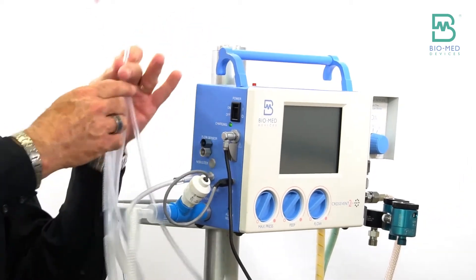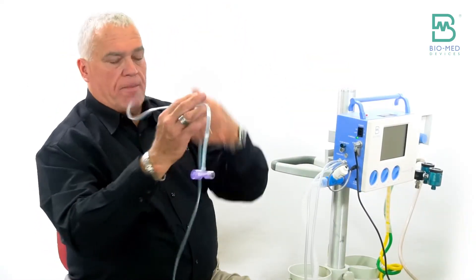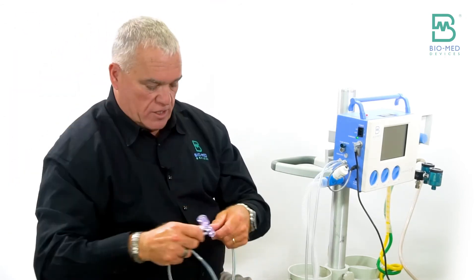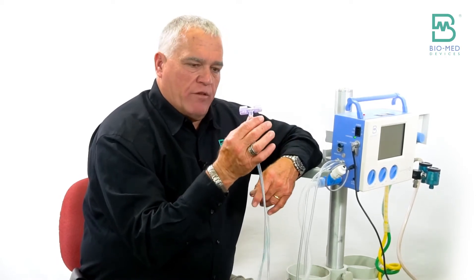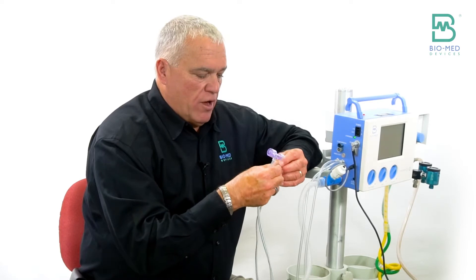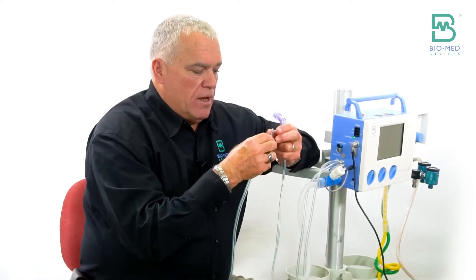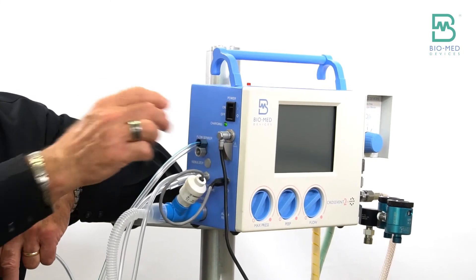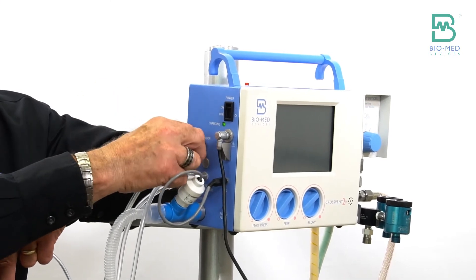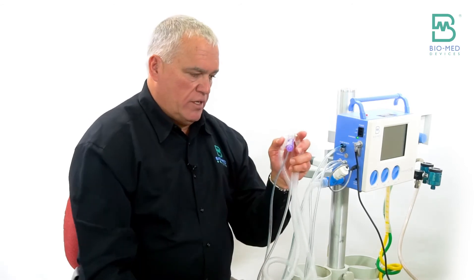As far as the flow sensor, we use this — we call it a pneumatack. This is how we're going to allow the baby to trigger the vent. We're also going to use this to measure exhale tidal volumes. There are two lines on this. One line has a little blue line on it, and the blue line attaches to the blue port as such. This connection only goes one way over the ET2.